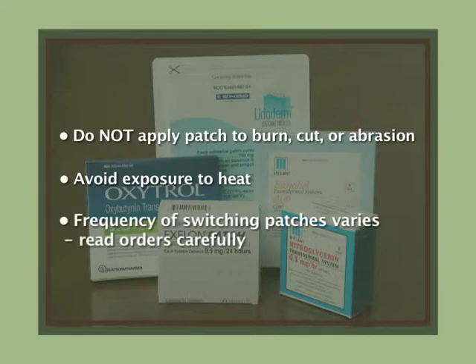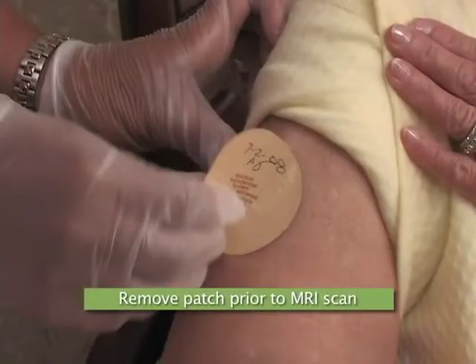Some patches are changed daily, some every 3 days, some once a week. So pay close attention to the prescriber's orders and directions for use. If a resident is scheduled to have an MRI, remove all patches prior to the scan, and remember to replace the patches after the scan.